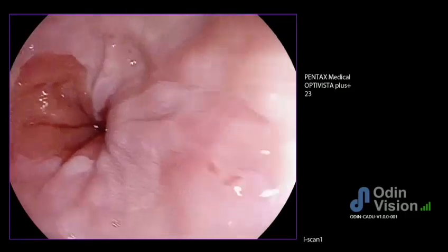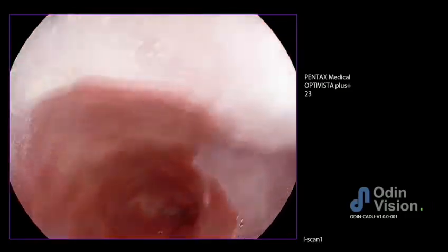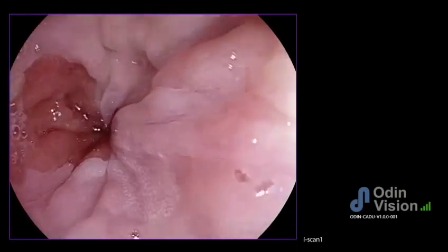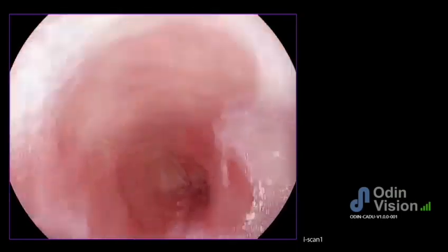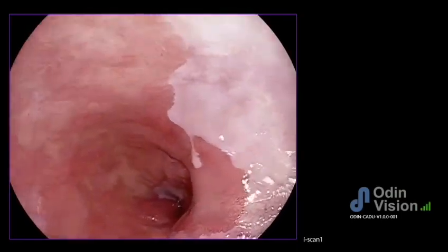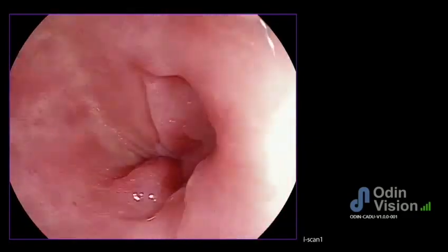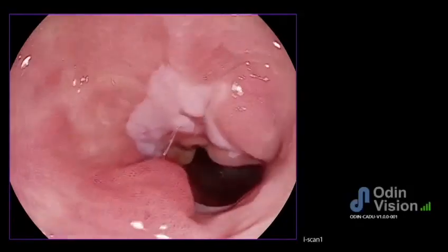to resect. To instigate the CADU, the endoscopist simply presses on a pedal next to his feet, and then a display appears on the right on a per image level telling us if there's dysplasia or not. So looking here at the Barrett segment, you can see an area of nodularity with abnormal pit pattern, abnormal vascularity, which we'll focus on in a second with the freeze frame.